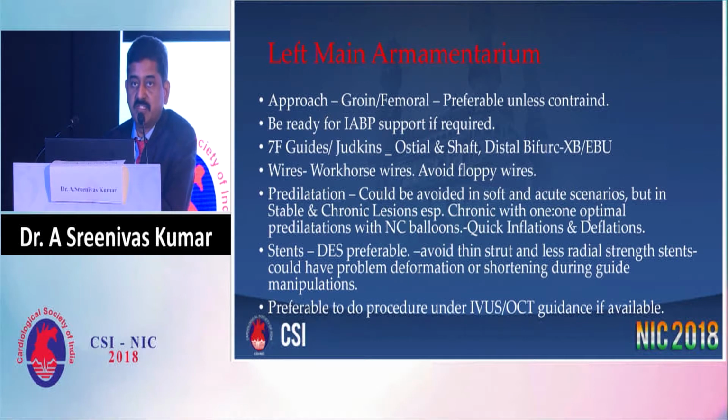Initially, there were some large size stents, and bare metal could also be used was the thought. Now it is proven beyond doubt that DES is the one to be preferred. And now bare metal stents are almost not available in the country.